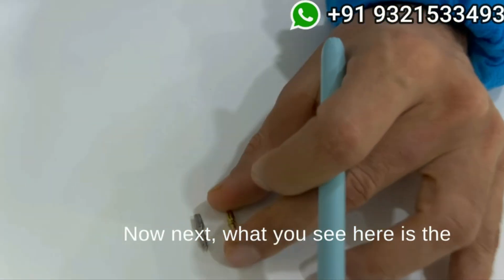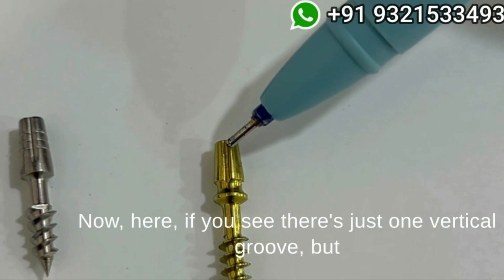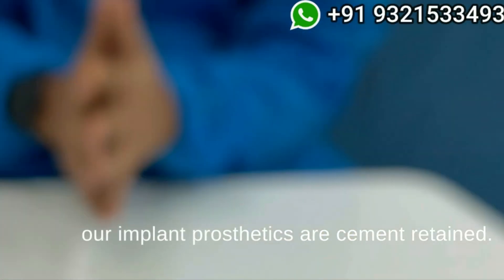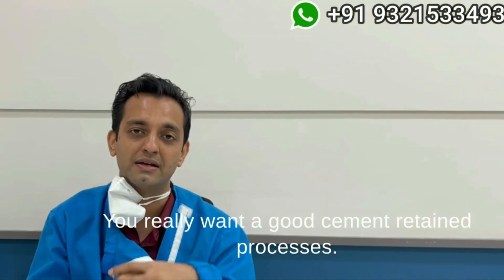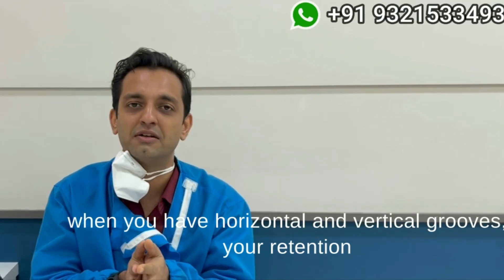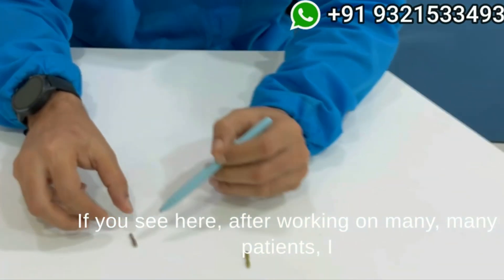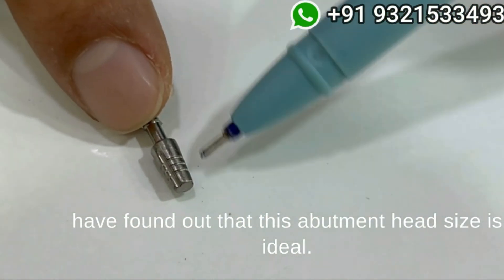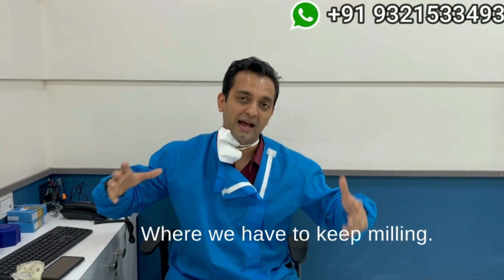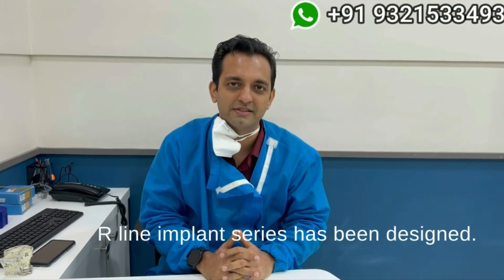The next feature is the horizontal grooves made on the abutment as well as a vertical groove. On the Impact implant there is just one vertical groove, but on the R-line you will see many horizontal grooves as well as a vertical groove. All our implant prosthetics are cement retained — you want good cement retention and don't want your prosthesis to dislodge. Horizontal and vertical grooves increase retention and surface area for cementing. After working on many patients, I found this abutment head size is ideal — not unnecessarily large requiring excessive milling, and not so small that nothing remains after milling. Based on all these experiences, the R-line implant series was designed.